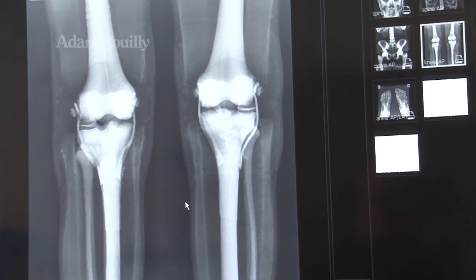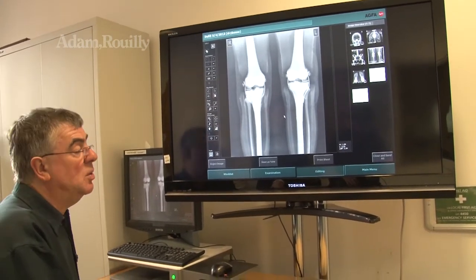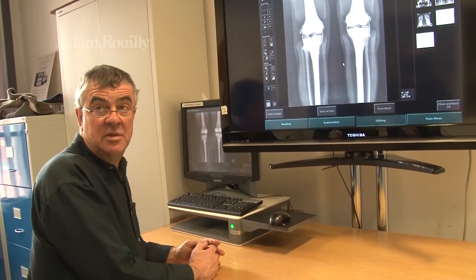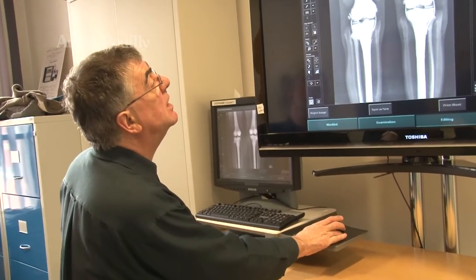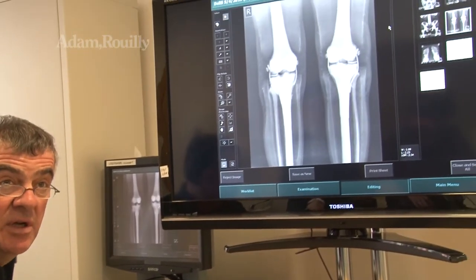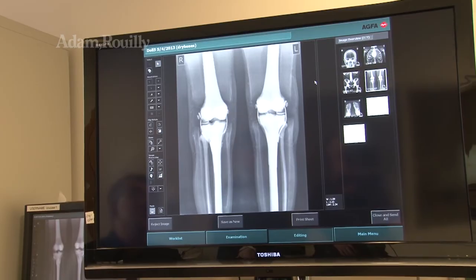But all dolls are different, they are individual, and some may vary a little bit, but this is partly the reason why we do this quality assurance process, to make sure that they meet minimum standards before they're sent out to the customers. Again, annotated right and left, just so that these images which are sent with the dolls, the purchaser can then see for themselves that they've got an annotated record of the examination and the product that they've purchased.